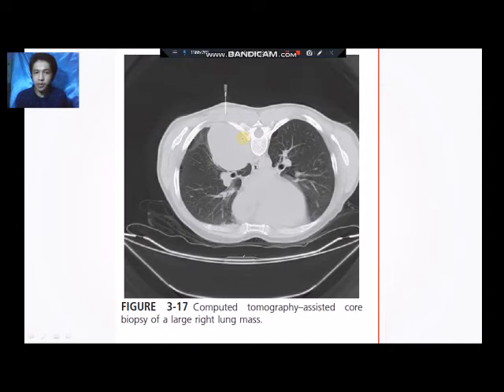So if a mass was seen, say the patient had a chest x-ray and a mass or formation was seen, after that diagnostic procedure the patient will be recommended for a CT scan along with a biopsy, to see how big the patient's mass is.